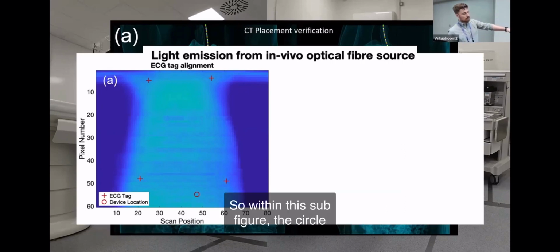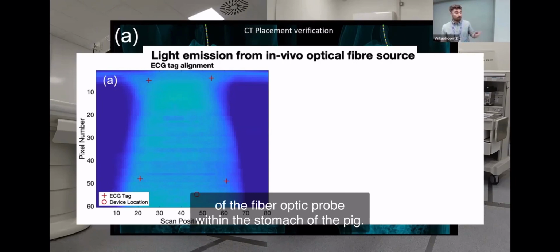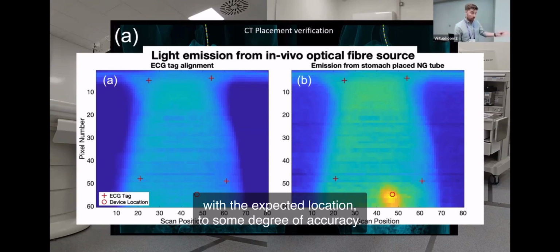So within this subfigure, the circle there really denotes the expected spatial location of the fiber optic probe within the stomach of the pig. And then we imaged the time-correlated light progression from the outside, and we see that light emission correlates quite well with the expected location to some degree of accuracy.